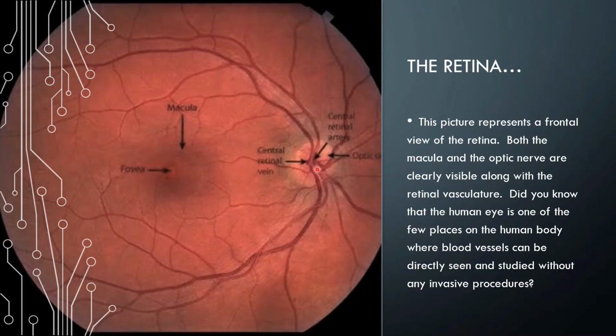This is the optic nerve, and this is the macula with the fovea in the dead center of it. So that's what it looks like, and that's basically what we see when we look in with our instruments and we're trying to assess the quality of these tissues. The thing I'd point out about this picture, though, is how vascularized this tissue is.